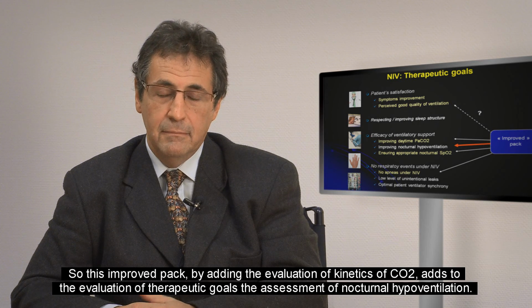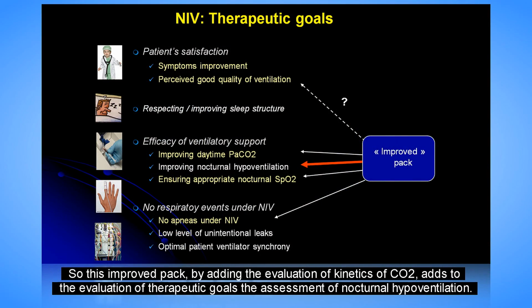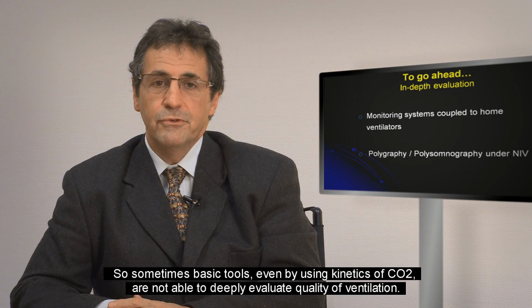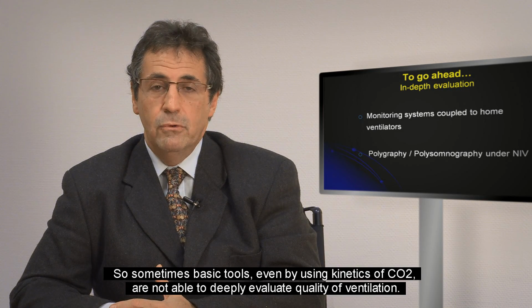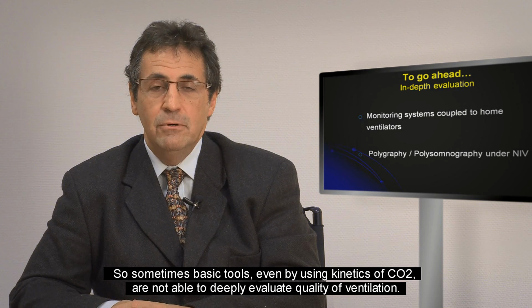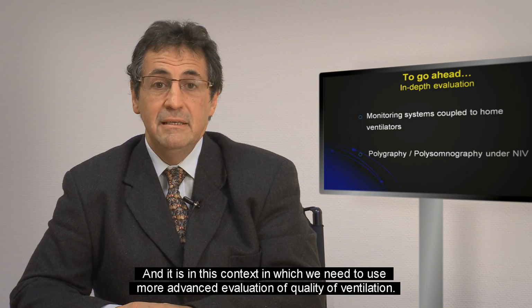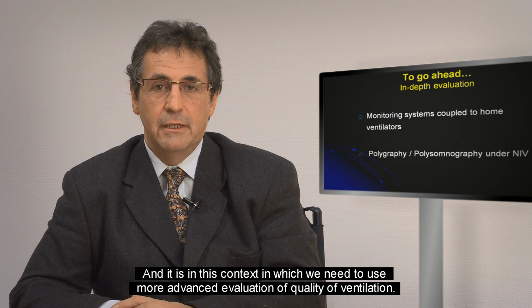So this improved pack, by adding evaluation of kinetic of CO2, adds to the evaluation of therapeutic goals the assessment of nocturnal hypoventilation. So sometimes basic tools, even by using kinetic of CO2, are not able to deeply evaluate quality of ventilation. And it's in this context in which we need to use more advanced evaluation of quality of ventilation.